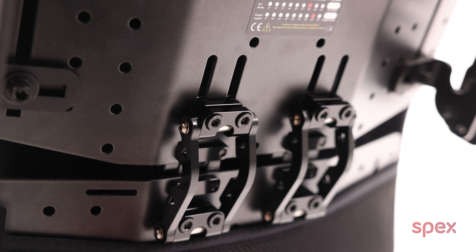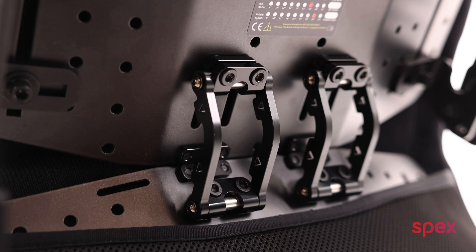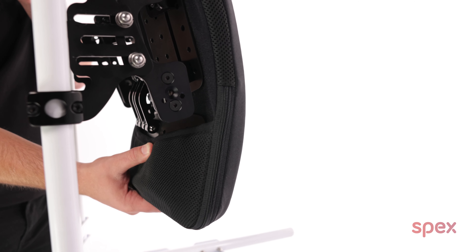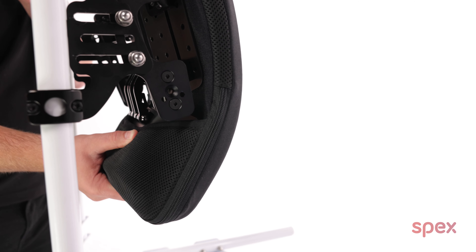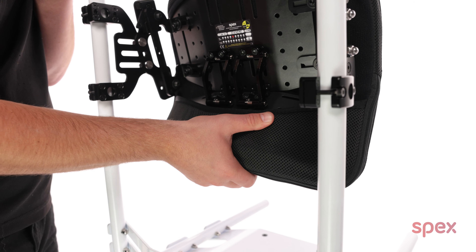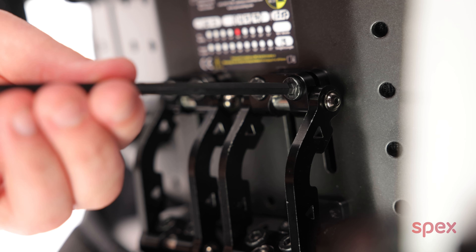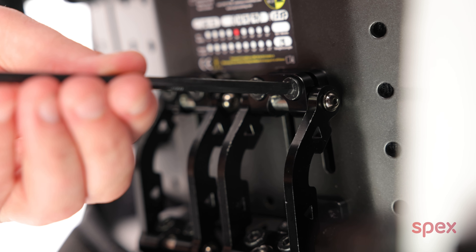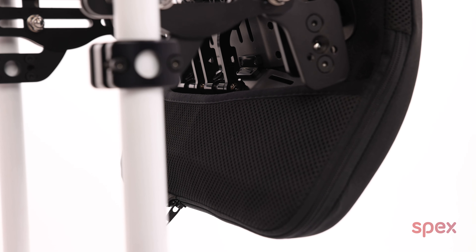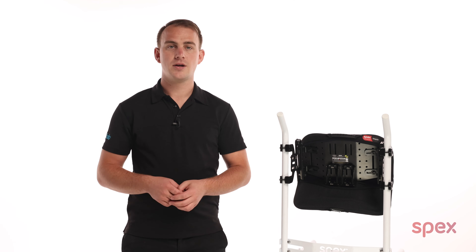Now you can slide the bottom section to the position you want. In this case I want to open the angle to relieve pressure on the pelvis. Once you have it in the position you need, you can tighten the bolts in place. Once tightened and positioned, you can be confident the profile curvature system will stay fixed in the desired configuration.